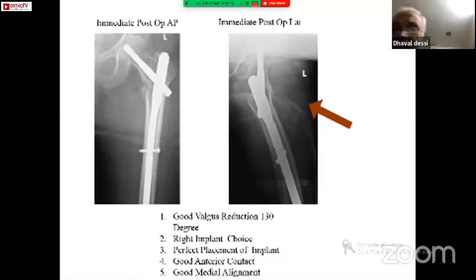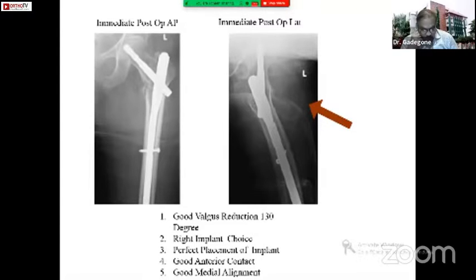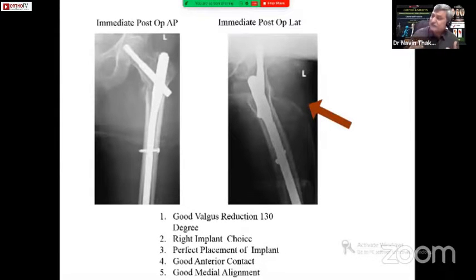So each fracture has a different instability. Each fracture has a different bone musculature stability. Each patient has a different bone musculature instability. So when we require a lateral stabilization, that is a question mark. We want to come out with a stability score of different points, and then we can decide whether this patient requires lateral stability or not. But till that time, we are doing some overwork, or we are doing 1 or 2 patients out of 10 more precociously and putting the lateral plate. But that is worth it to prevent the further complication of medial migration or losing the head without salvaging.